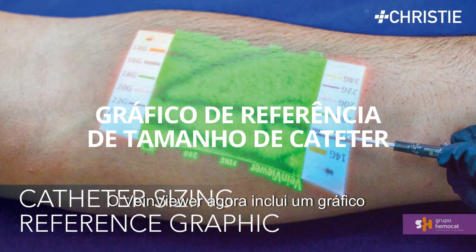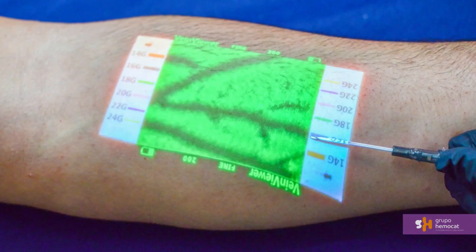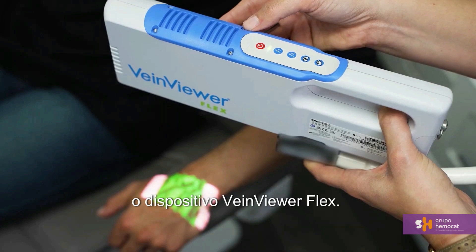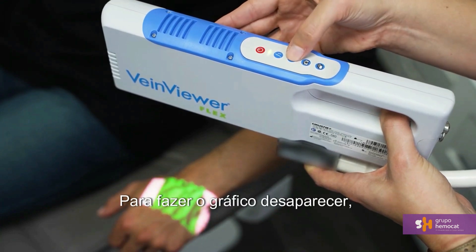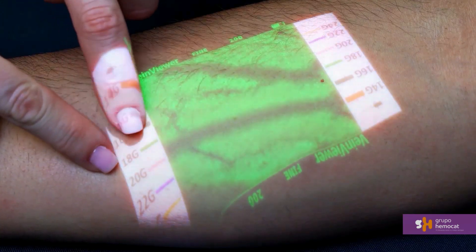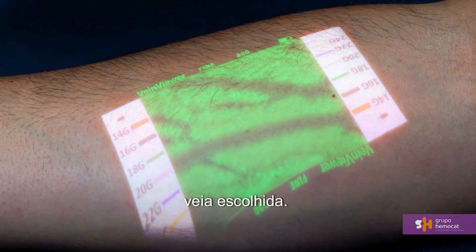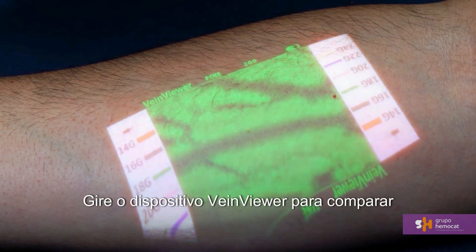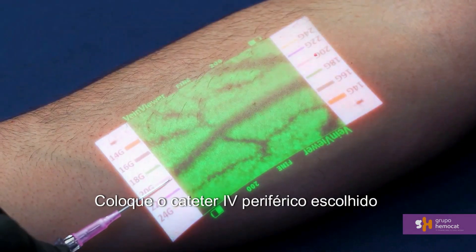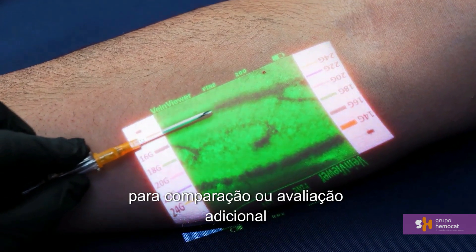VeinViewer now includes a peripheral IV catheter sizing reference graphic to support your vein evaluation and selection process. The catheter sizing reference graphic will automatically appear when turning on your VeinViewer device. To make the reference graphic disappear, press and hold the F2 button; press and hold again to make the graphic reappear. To utilize the catheter sizing reference graphic, align the colored size marking to the chosen vein. Rotate the VeinViewer device to compare each catheter size for the appropriate selection. Place the chosen peripheral IV catheter on the reference graphic and selected vein for additional comparison or evaluation prior to insertion.